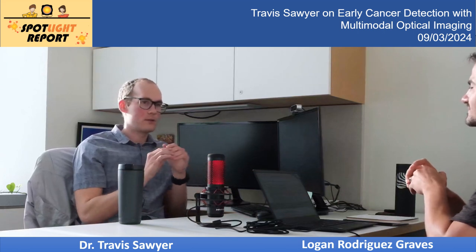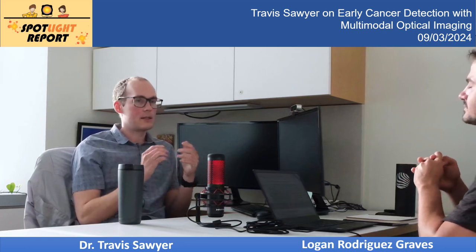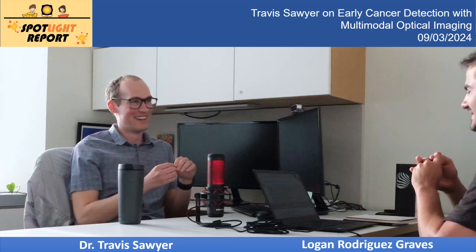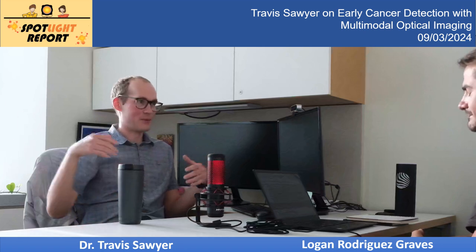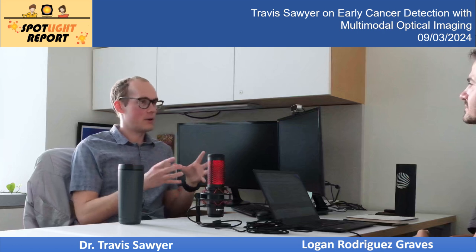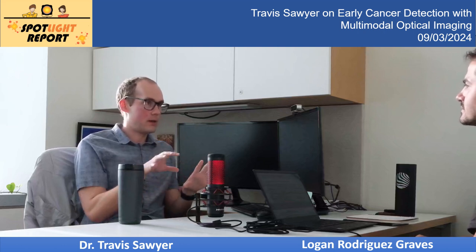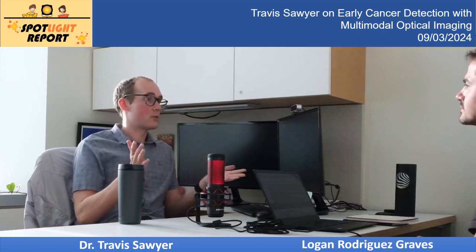I think we limited ourselves to a pretty well-known one called linear discriminant analysis. I think it's usually used in cases where you have quite a few features and not tons of samples. So almost all of biomedical imaging. Yeah, right. I think things like MRI, X-ray, you can get many, many, many samples and start doing cool machine learning stuff. But for these initial scenarios, you want to do a nice, well-constrained model. But the goal there was really to get it to, purely based on the numbers, tell you what is the probability that it's going to be cancer or normal, and classify it into one of the two groups.